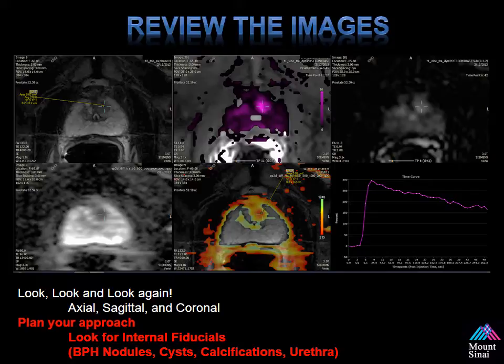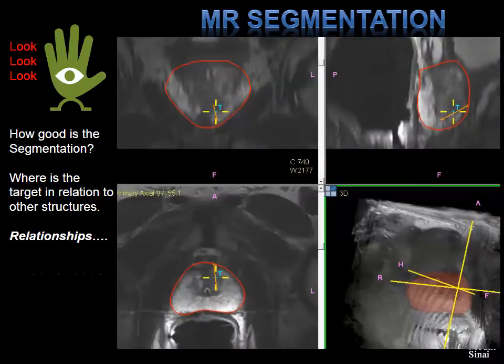So before moving on to the next slide, I think it's really important to understand that reviewing your images will impact your results and make you more successful while performing these fusion biopsies.